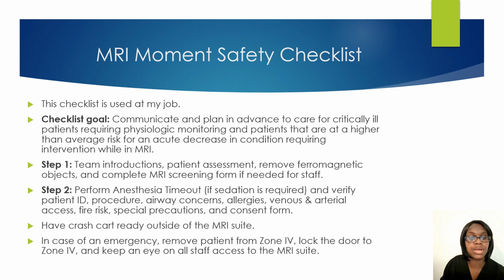Have the crash cart ready, but outside of the MRI room, and just make sure that everyone knows when to go inside the MRI room, what to bring in, what not to bring in. You, as a technologist, need to keep an eye on the staff and the MRI suite and door.